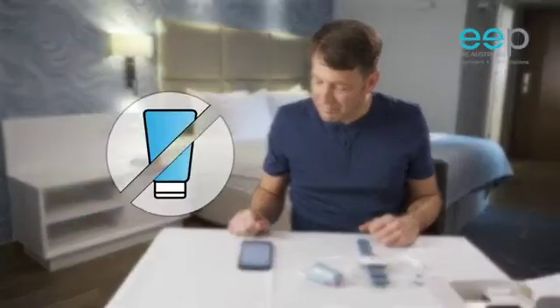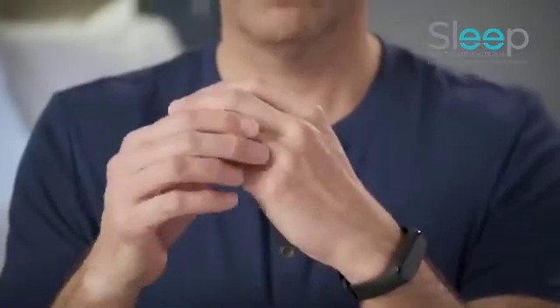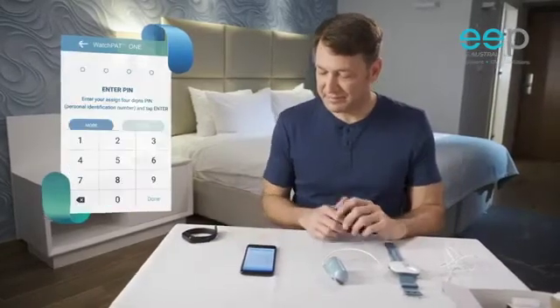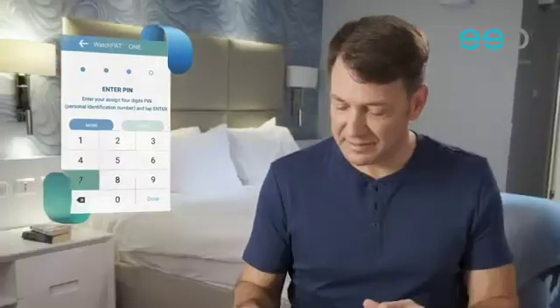Please avoid using hand cream and make sure your fingernails are trimmed before continuing. Remove all jewelry and accessories, and then press next. Now enter the four-digit PIN code provided by your physician's office and press enter.